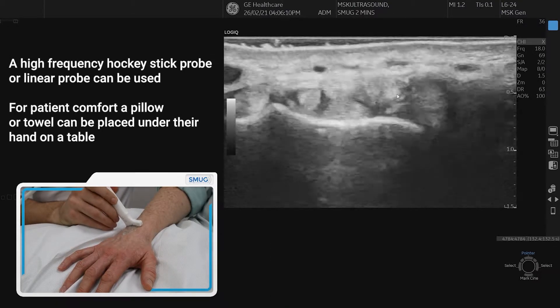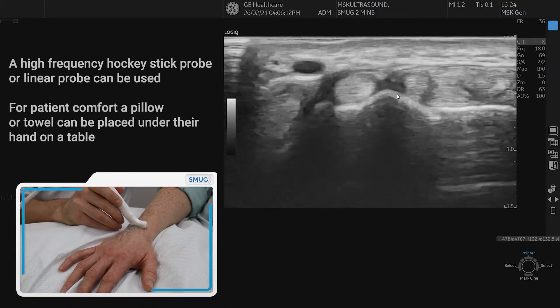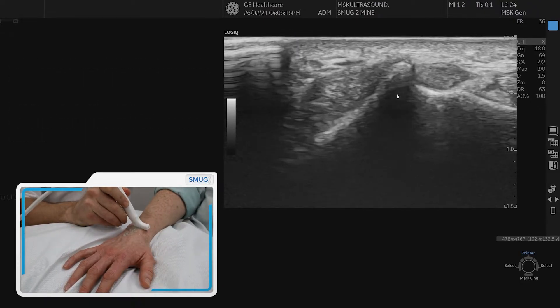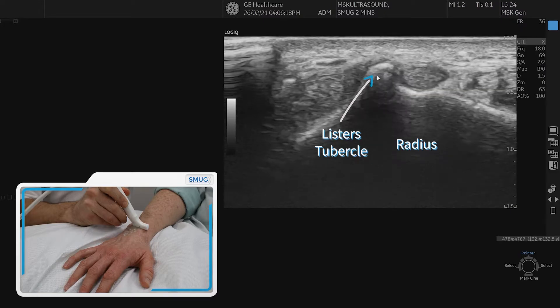The first landmark to find — really important just to start orientating exactly where you are — is Lister's tubercle, and you can see Lister's tubercle pointing nicely there.